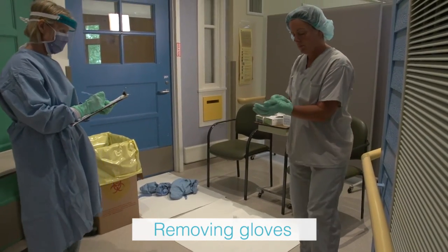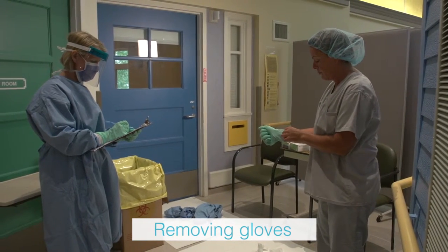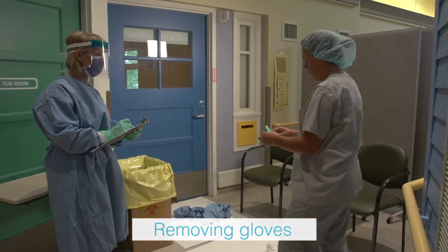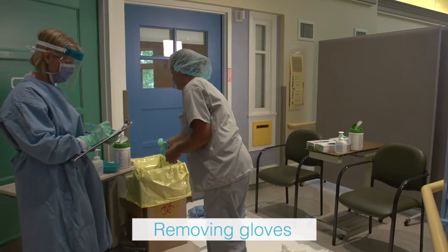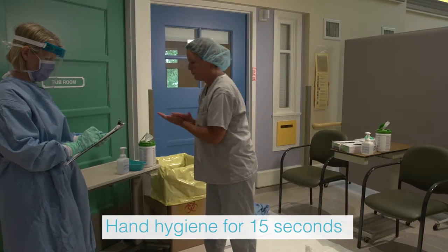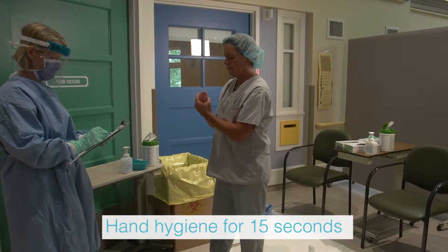The health care provider removes the inner glove by grasping the outer edge near the wrist and peeling away, rolling the glove inside out. Slide one or two fingers under the wrist of the remaining glove and peel away. Discard immediately into the waste receptacle. Perform hand hygiene using alcohol-based hand rub and allow hands to dry completely.